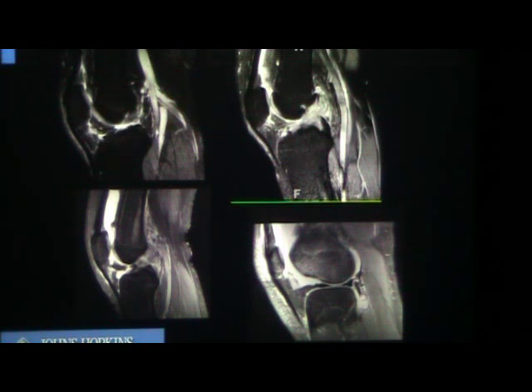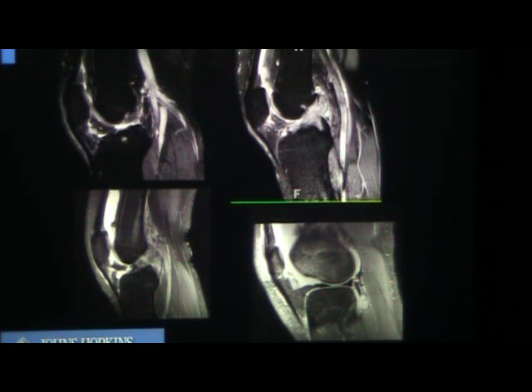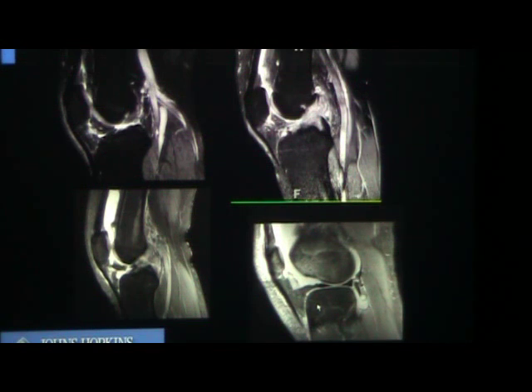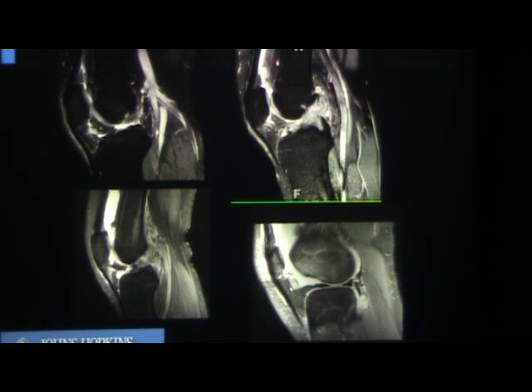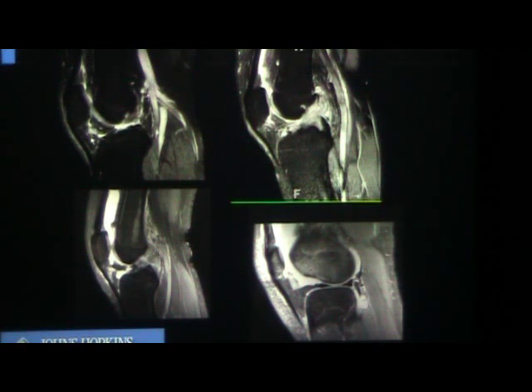The inferior plica goes to the Hoffa's fat pad. A normal one shows a little bit of signal, but in this case there's a lot of signal — this is called a sprained ligamentum mucosum or sprained inferior plica. Sometimes you can see tears: when you see fluid outpouchings in the Hoffa's fat pad with a lot of edema, that's a torn plica. With ACL injuries, you commonly get shearing injuries to the Hoffa's fat pad and plica injuries. If the patient has anterior pain, nothing else is happening, and you see edema in the area of the ligamentum mucosum — that's the diagnosis.